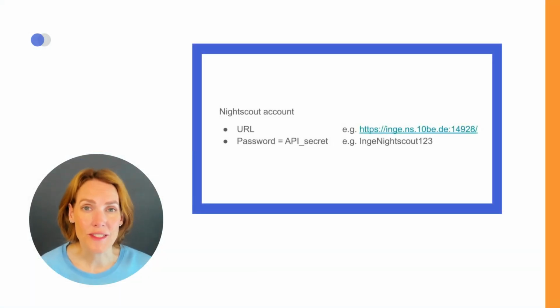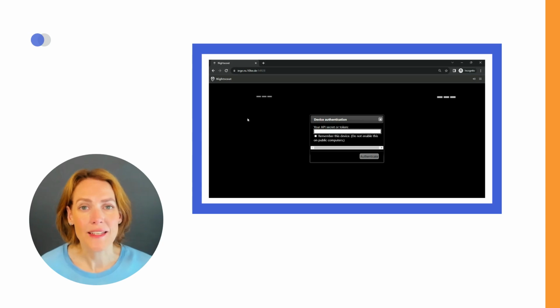A Nightscout account consists of a website URL, name, and a password to access the website. Nightscout accounts are created as individual user accounts. There is no Nightscout platform specifically for healthcare providers.